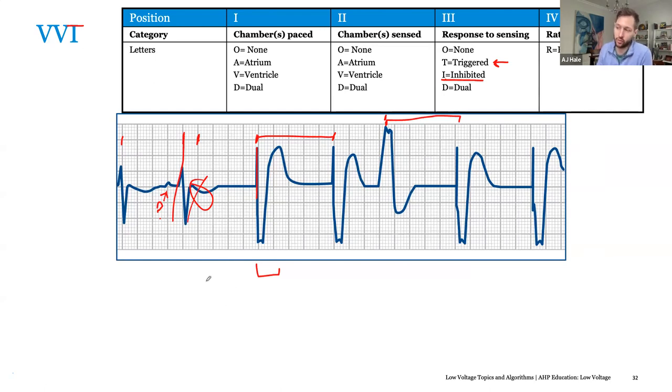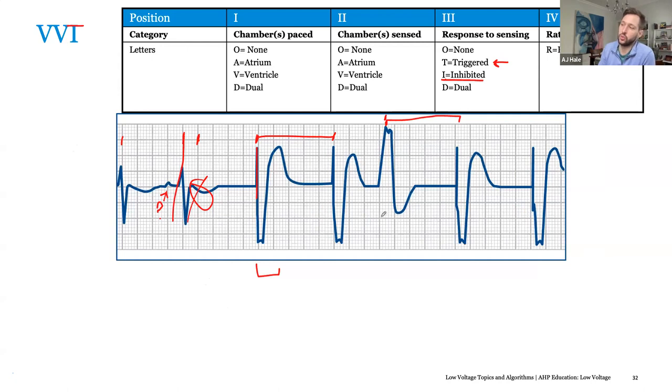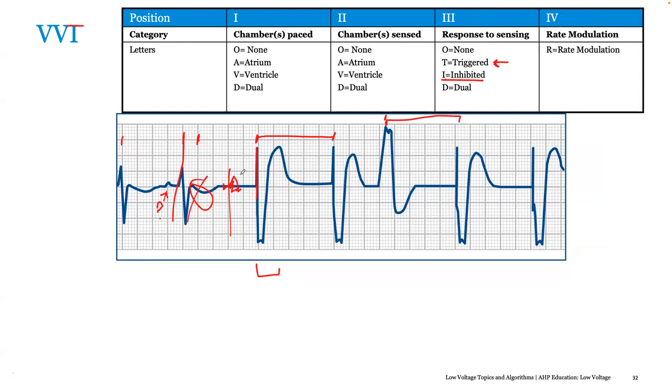Another is if you have a patient with occasional noise, that's not that bad. It may be advantageous to pace into it. Say this is noise here, it may just try to pace, just in case. If this is noise, we go ahead and depolarize the heart, and if it's not noise and it's a true event, you just kind of fuse with it. So it's used as a safety pace, and it's used as increasing your bi-V pacing.